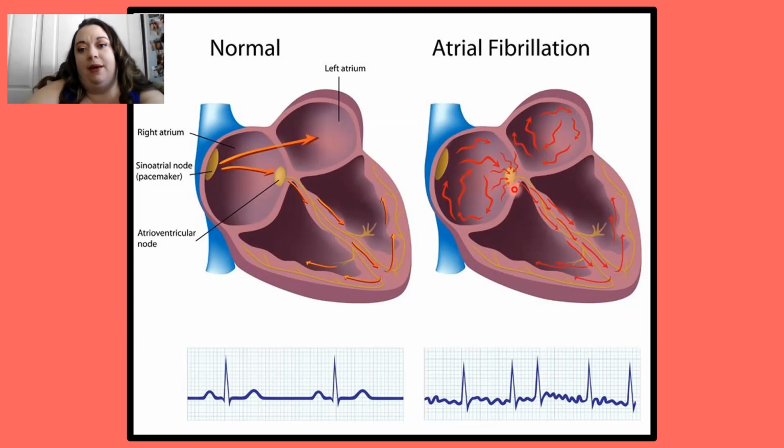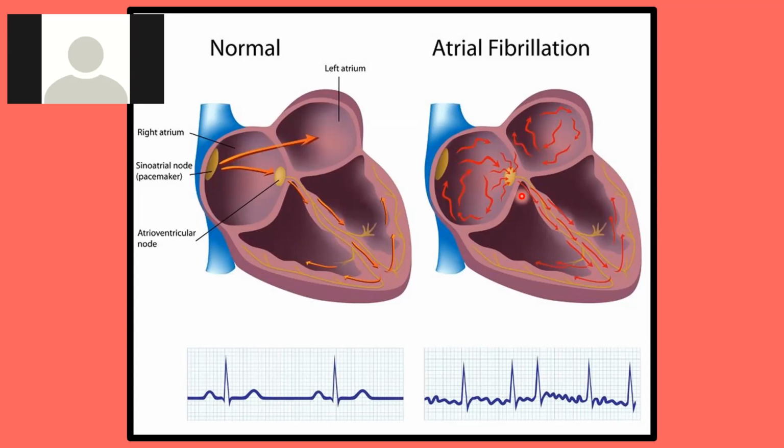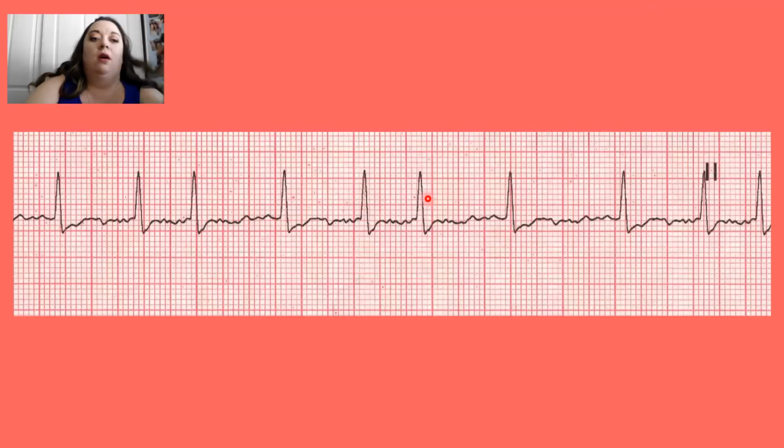What happens in AFib is you have a ton of signals coming down to the ventricles, and there's a point, like a refractory period, when they can't fire. So it might send down 10 signals, and the ventricles can only respond to 4 of them. Does that make sense? They're getting more signals than they can handle. Because of that, it's irregular. I'm having all these random P wave signals coming down, and every so often your ventricles are able to reply to one of those.